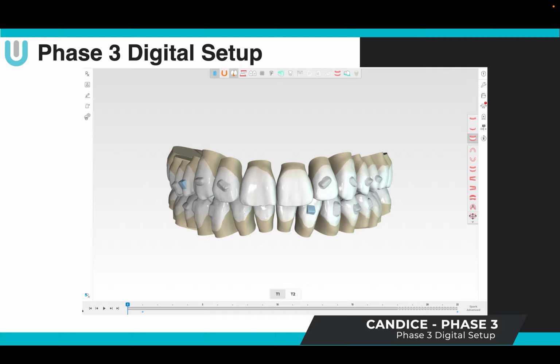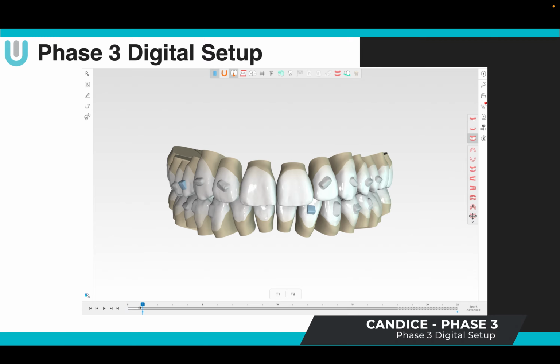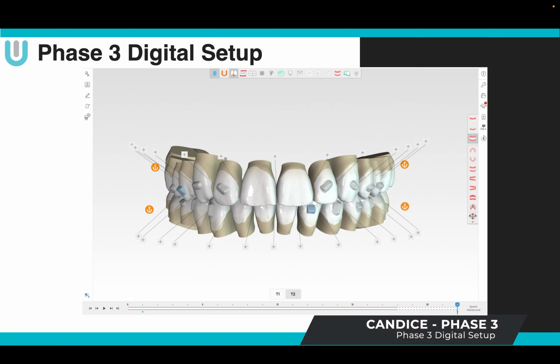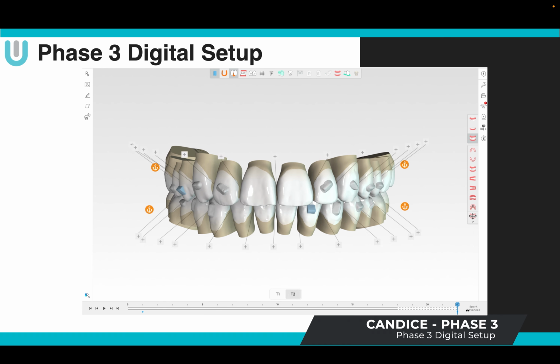Well, I don't like the lower left lateral incisor. I do want to get those bicuspids tipped in. You can see that upper right, it's sticking out. So I put an incisal bevel attachment. Why did I put an incisal bevel attachment?